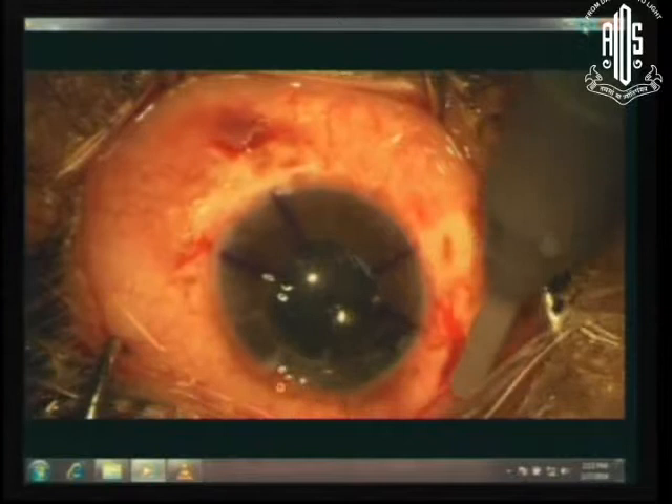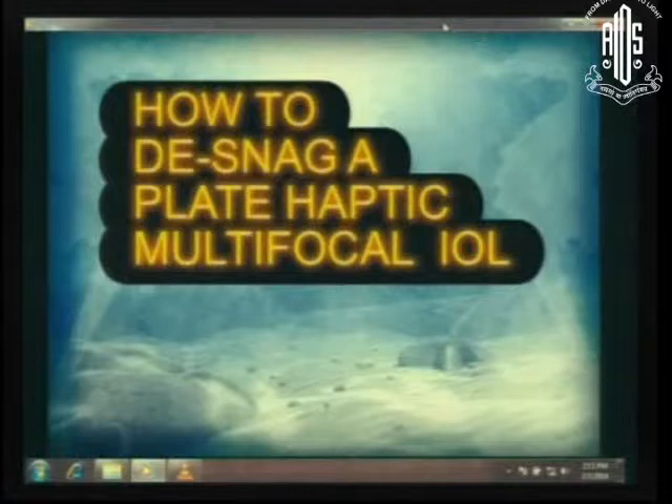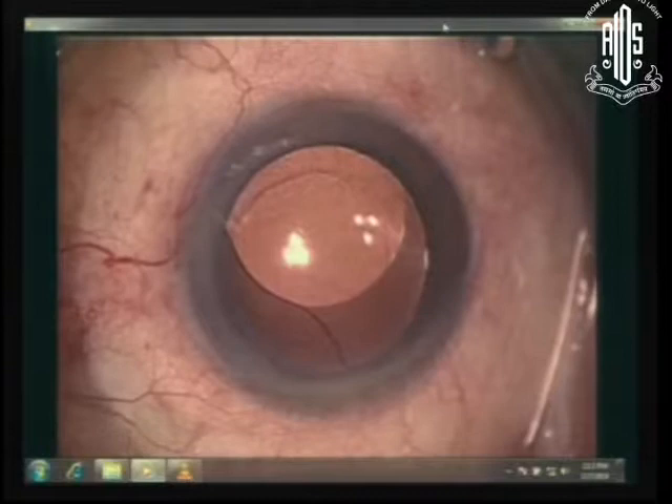I have another quick video just to show you that sometimes a multifocal lens is decentered — I call them snag. This is a multifocal lens that was implanted four months earlier; there was a traumatic injury where a spoon hit the eye, and the lens decentered. Now if you look at this, you know it's a plate haptic lens. You can't suture a plate haptic lens — the only way is to remove it.